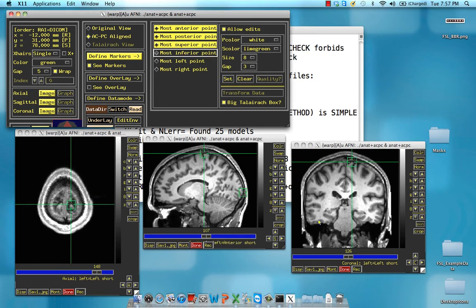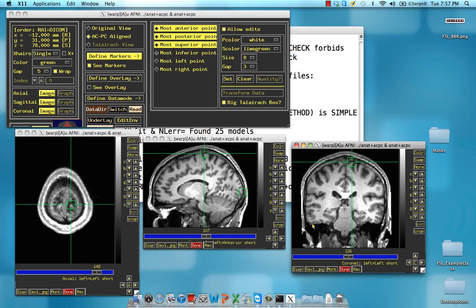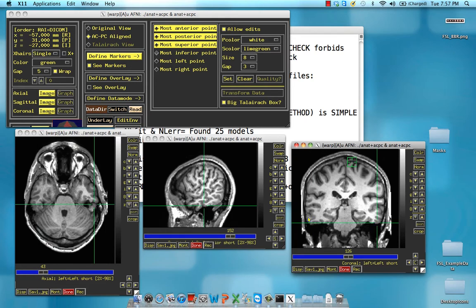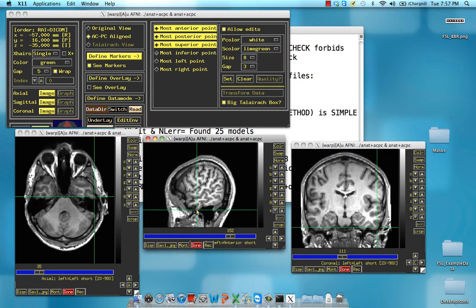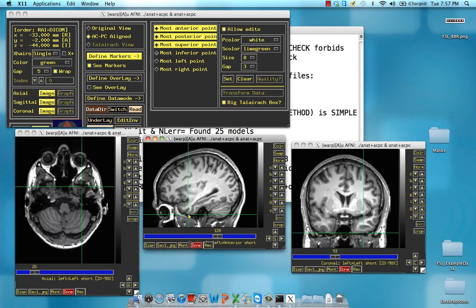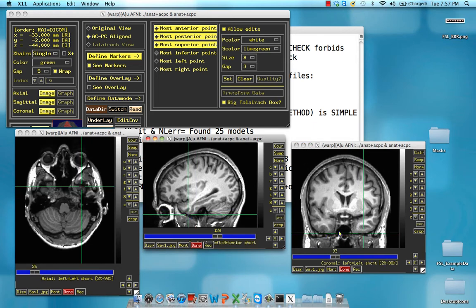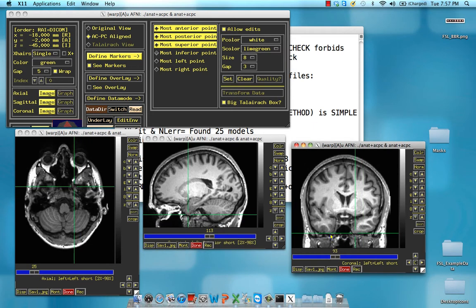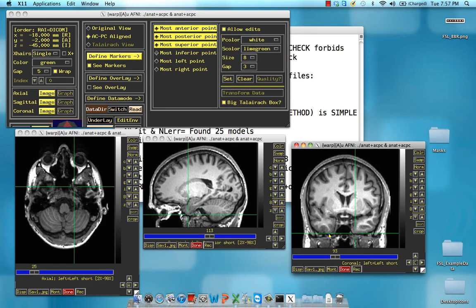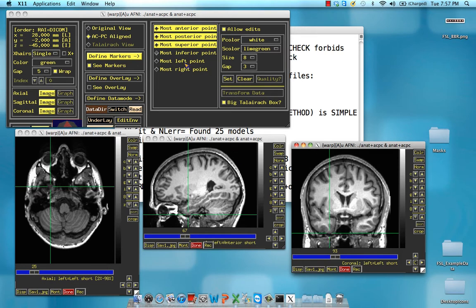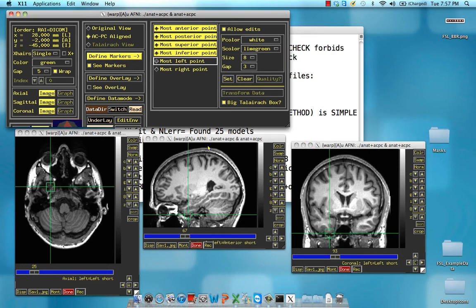The most inferior point is a little tricky — it's going to be at the very base of one of the temporal lobes. Check the right, check the left, and remember to use all three views. You might think you have the most extreme point based on just one view, but click around until you're sure you're at the very base. In this case, right about there. Set the most inferior point.